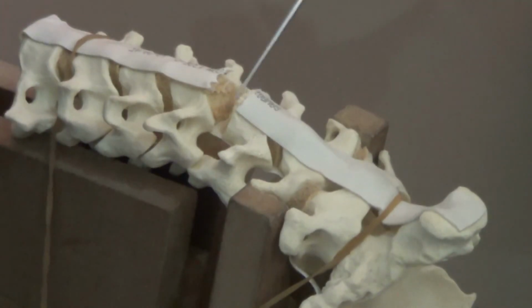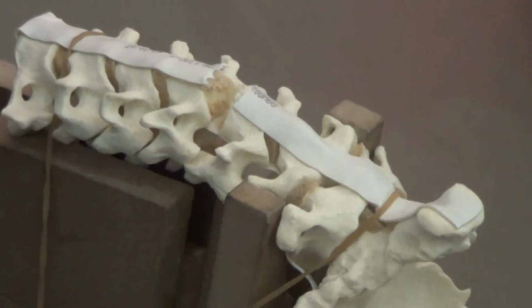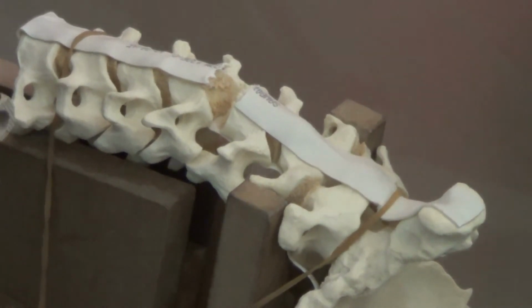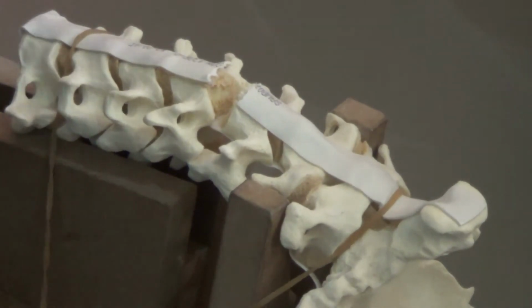So you have successfully removed all the redundant posterior ligament, and if it is well visualized, you can even see dural pulsation. When you see the dural pulsation with your own eyes, you are sure that it is totally decompressed. No pressure over the spinal cord, no pressure over the root. Then you will be satisfied.